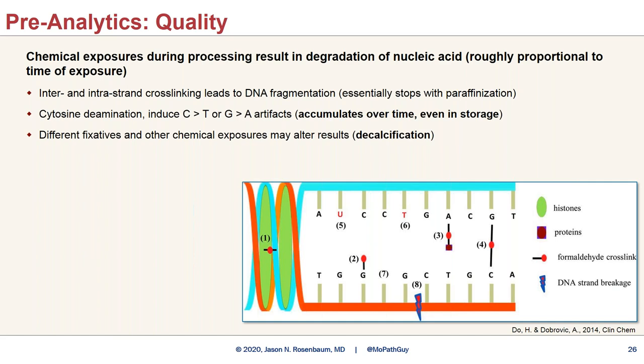And the important difference between this artifact and the fragmentation artifact is that this artifact continues to accumulate over time, even in storage. And there's very little that can be done about it at this time. And so it's worth considering whether sequencing from archival specimens in a clinical context is advisable.